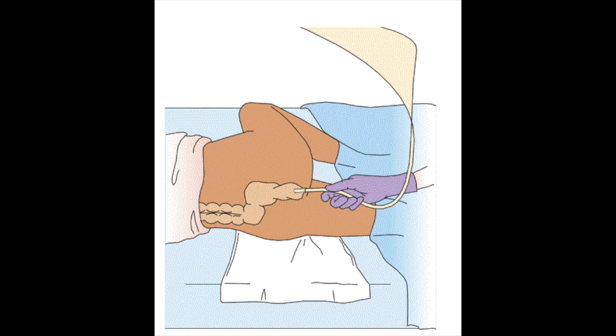Next, you want to provide privacy by closing the door and/or curtain in the patient's room, and this helps to minimize embarrassment. Next, place a bedpan, a bedside commode, or make sure the toilet is in an easily accessible position. Next, perform hand hygiene. After that, help the patient into a side-lying position with right knee flexed. This allows the enema solution to flow downward, thus improving retention of the solution.